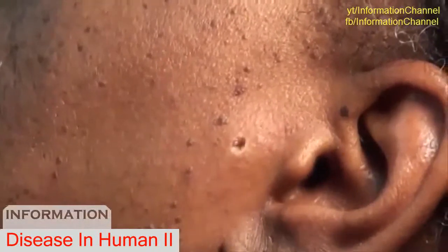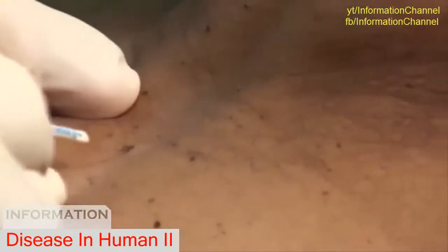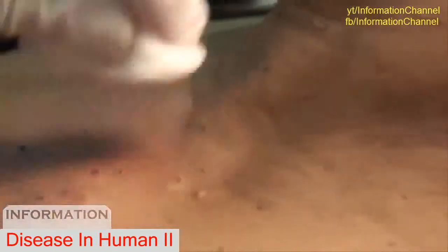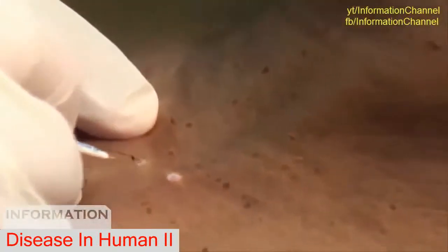But I don't think that's necessarily representative of some of these other more superficial ones. That's the worst one, of course, but let's see how she responds down here. That's more what I was expecting — it just goes right away. Beautiful.